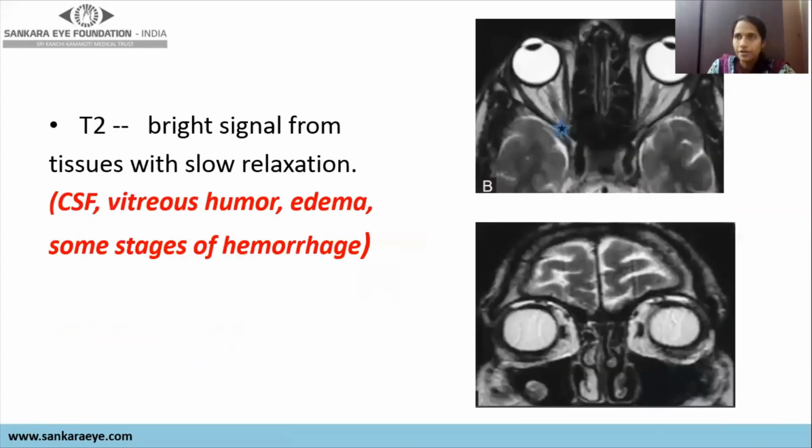So here I already mentioned the protons which are subjected to a magnetic field and a radio frequency impulse will remain in a higher excited state. Tissues like water, CSF, vitreous, edema have an excessive amount of free protons, and these free protons will remain in an excited state for a long time, and it will take a longer time for them to relax back to their resting state.